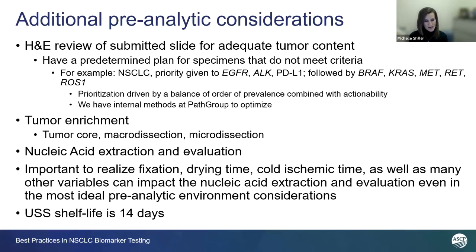Nucleic acid extraction, the whole method is important, as well as the evaluation of the quantitation of the DNA, and that has to be documented as well. And as I already mentioned, fixation is important, drying time, cold ischemic time, and all these other things that happen before the specimen ever actually reaches the molecular lab for downstream testing. Finally, unstained slides do have a shelf life. Really, the long end of that is 14 days.